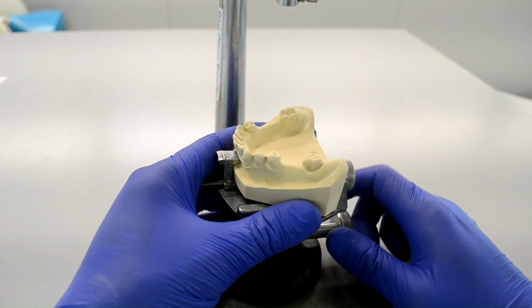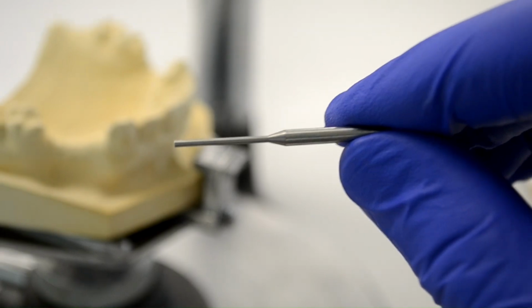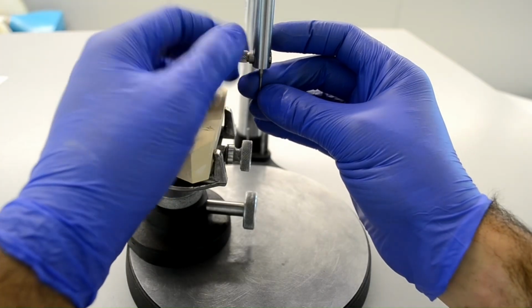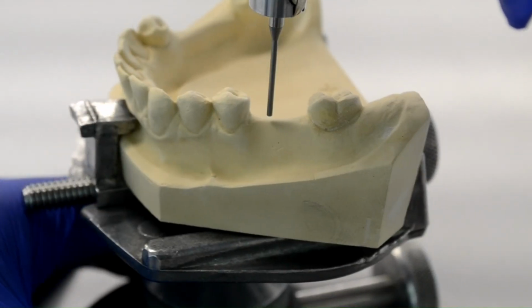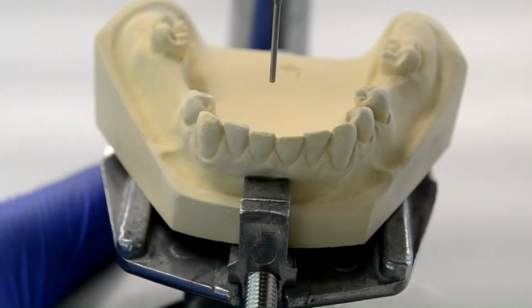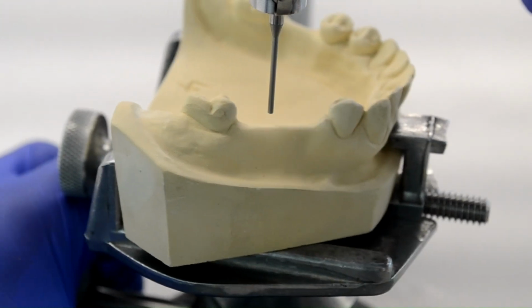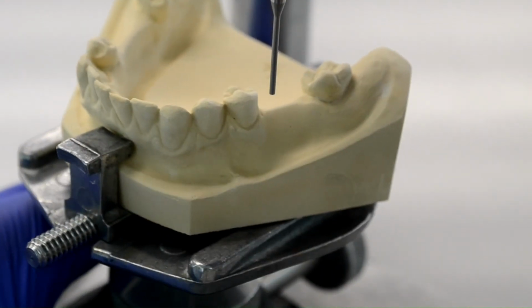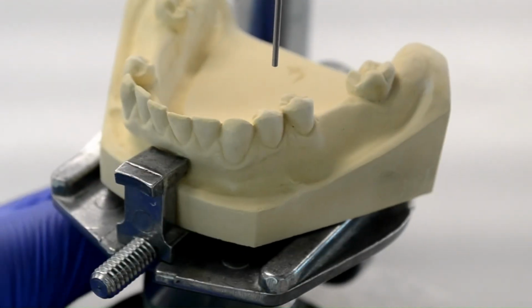The first step of surveying is to analyze the cast. This is done using the analyzing rod, which looks like this. We'll go ahead and put that into the mandrel. The goal of analyzing the cast is to identify a path of draw that would require the least amount of adjustment on the guide plane areas. The ideal path of draw would require even adjustments on all abutments, rather than no adjustments on some abutments at the expense of the others.